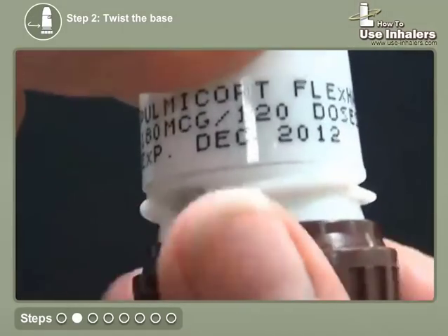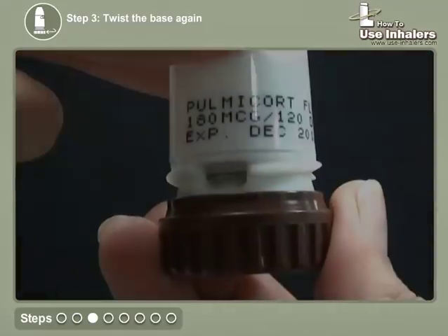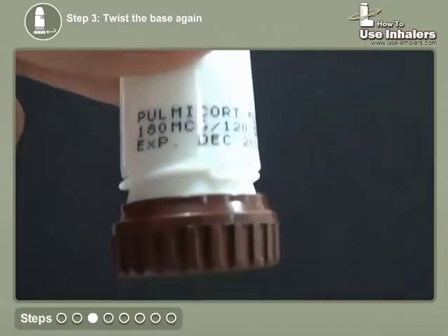Twist the brown grip in one direction as far as it will go. Twist the grip fully back again in another direction. You will hear a click.